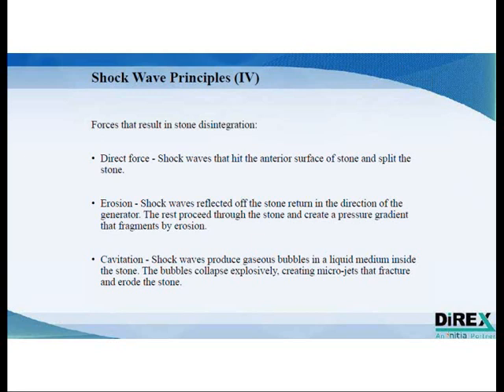The third process, and a very powerful process, is cavitation. It's the formation under pressure of gas bubbles, which then collapse and cause erosion of the stones. Now, as you treat a stone, you cause fractures inside that stone. Thus, you allow water to penetrate inside the cracks of the stone, and the effect is magnified with time. Usually, a stone will require anywhere up to 2,500 to 3,000 shocks in order to fully disintegrate it.